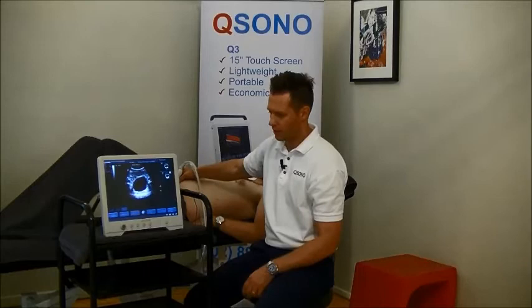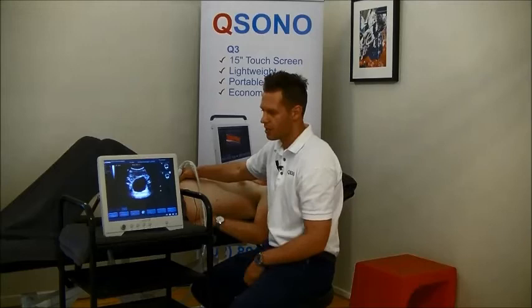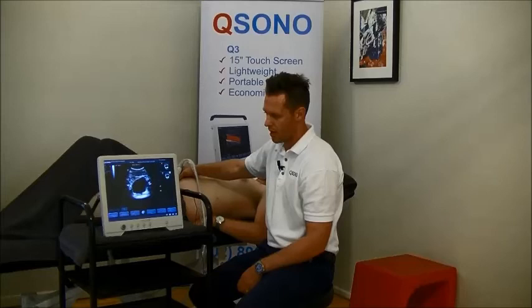Okay, now that we've got our image here of the bladder, we're interested to see what happens when the patient does different types of movements. So first of all, I'm just going to ask the patient to take a deep breath in and breathe out. And you can see that the bladder moves up and down with inspiration and expiration.